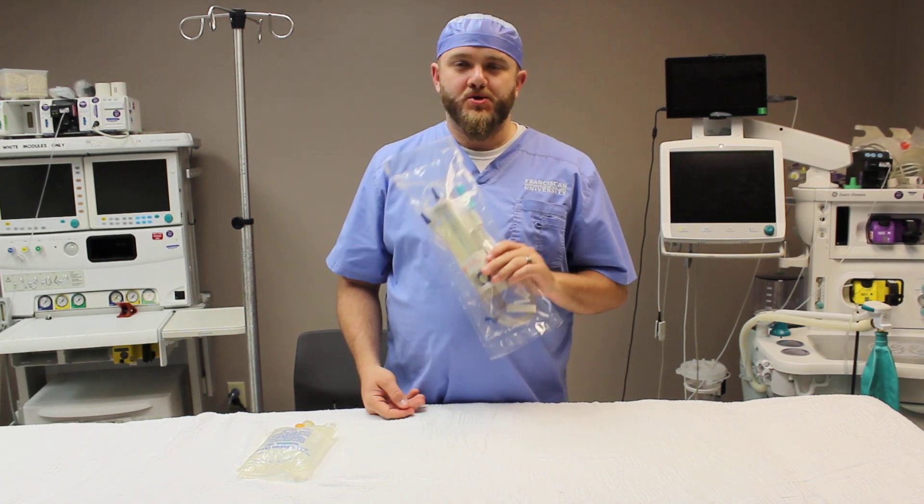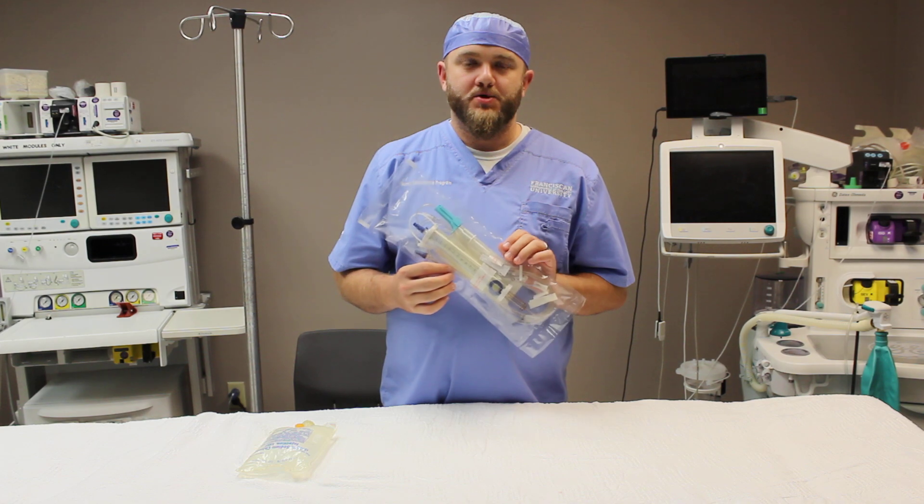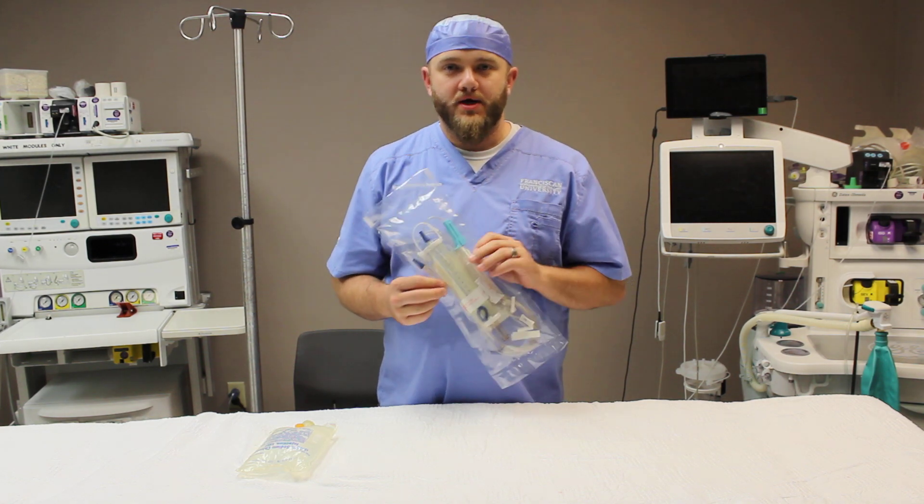Hi, I'm Trey Warren and this is a quick introduction video of how to set up a buretrol IV system for pediatric cases.